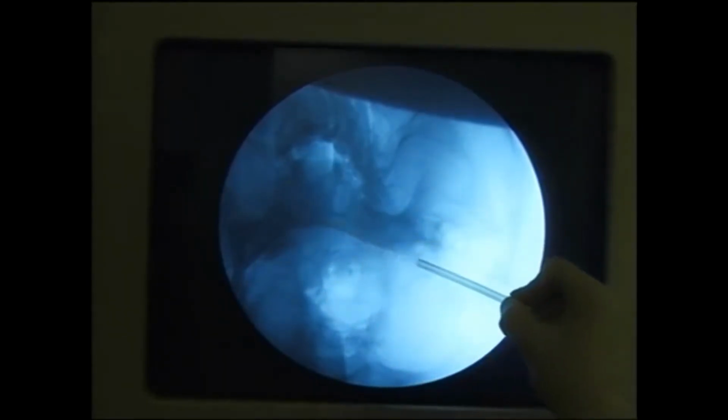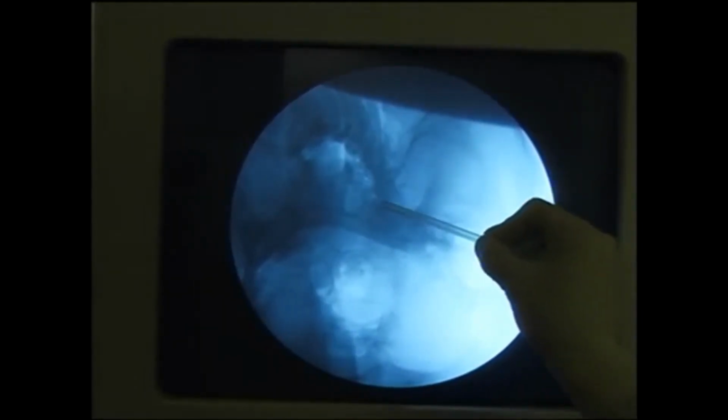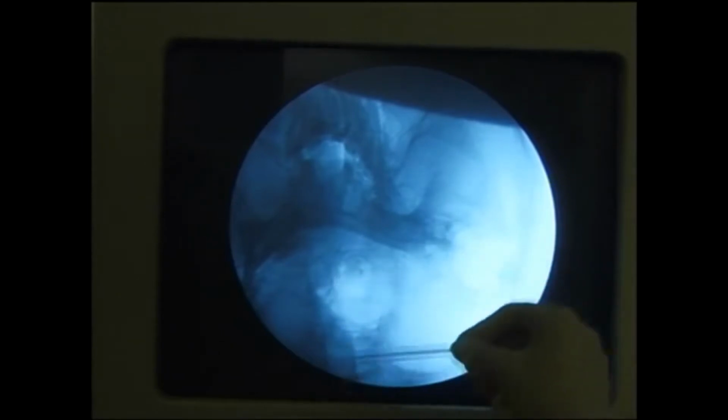This is the mandible, this is the angle of the mandible, the TM joint is here, the mandibular notch is here, the ramus is here, and the teeth are here. Here is the maxilla, then a bit of mastoid, and then the cervical spine itself. Our area of focus is between the maxilla and the mandible.